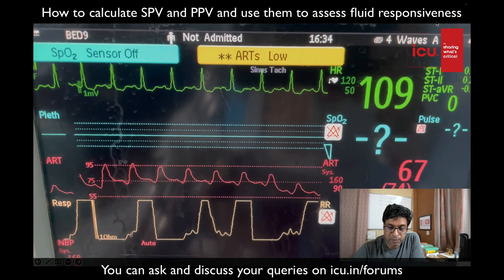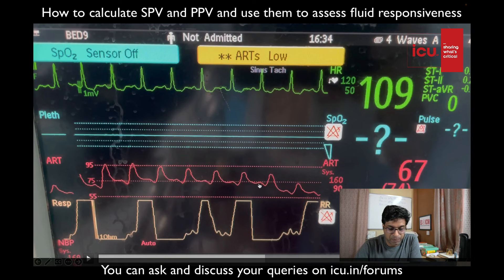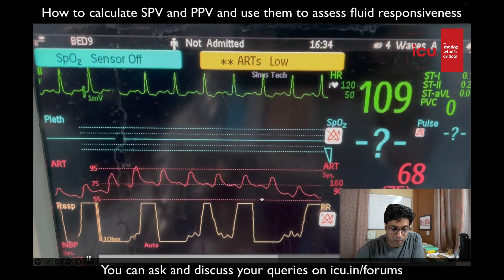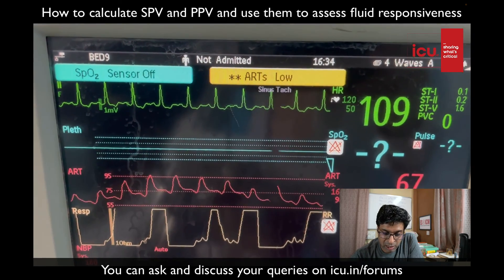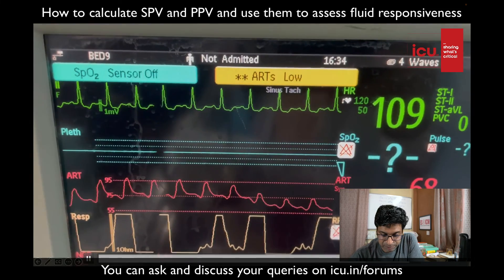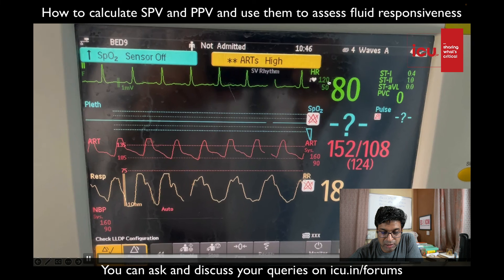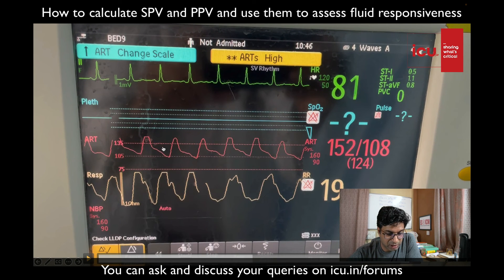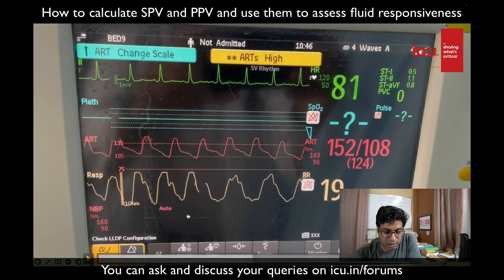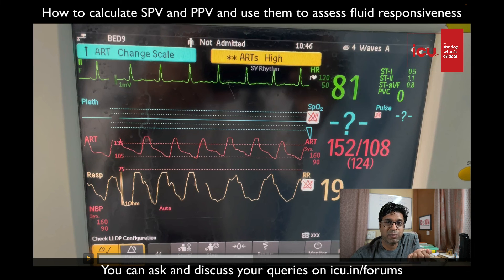Other clues confirmed it — tachycardia and hypotension. We gave the patient a fluid challenge. You can now see the heart rate has decreased, pulse pressure variation has gone down, and there is no longer too much difference between systole and diastole. Hypotension is reduced, tachycardia is reduced, and the variation is reduced. Our patient responded to fluids.